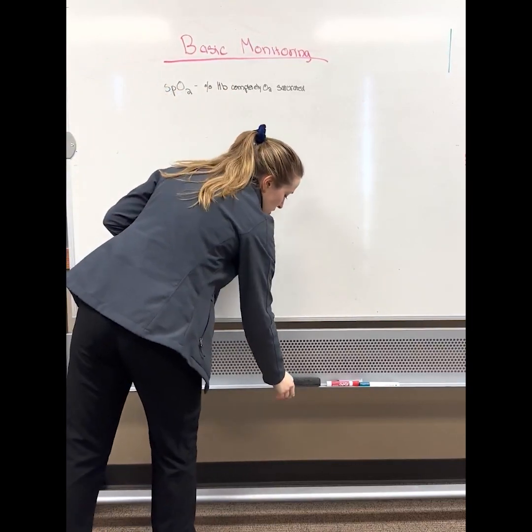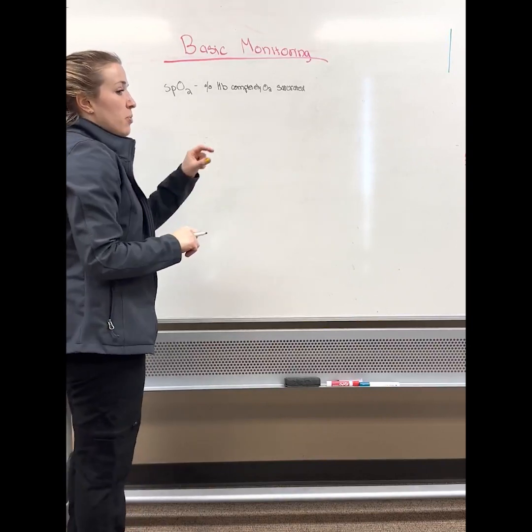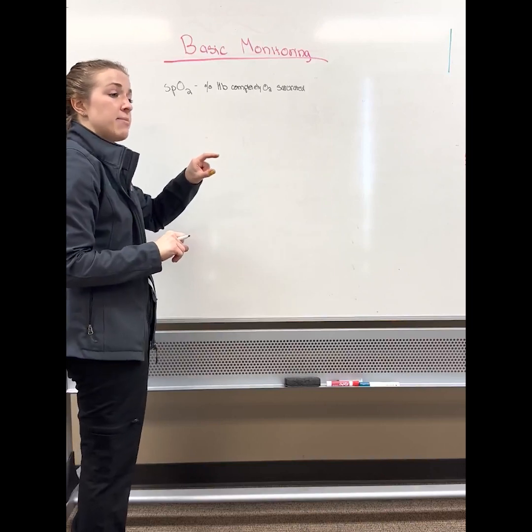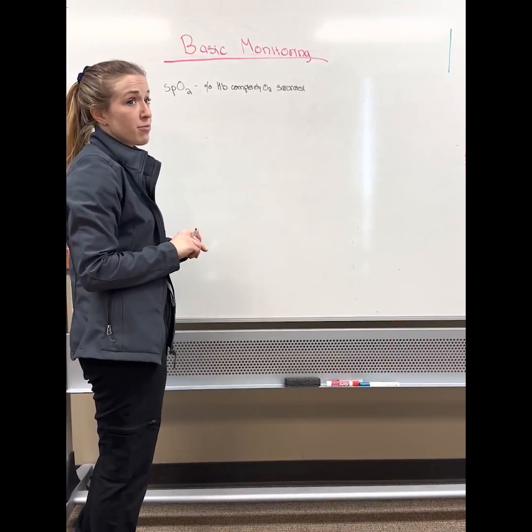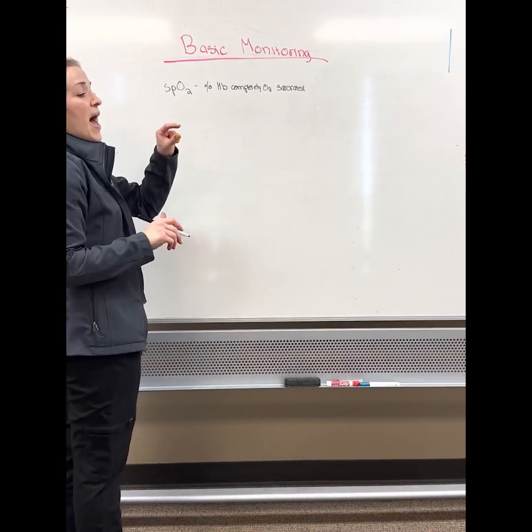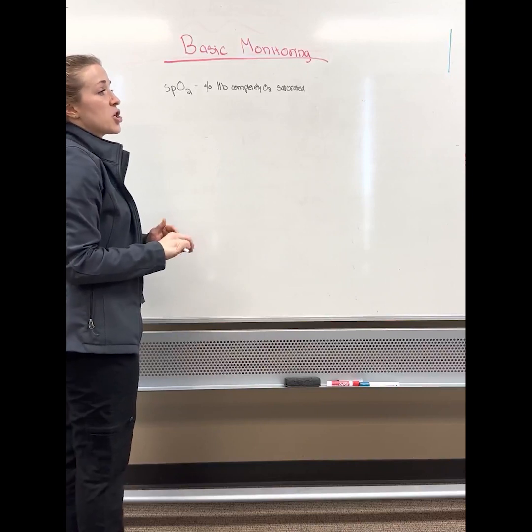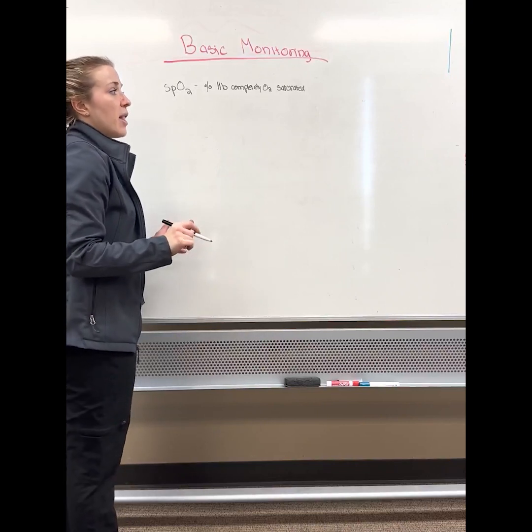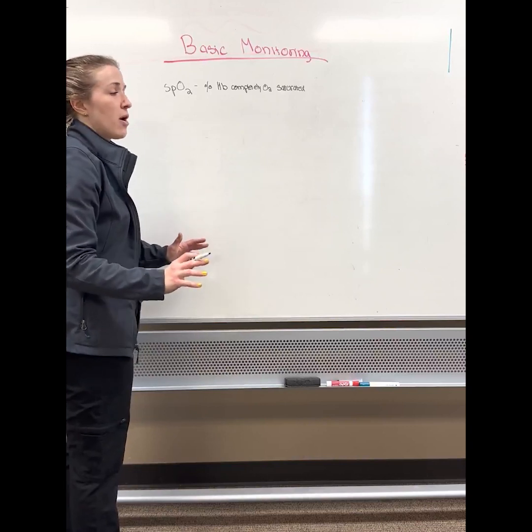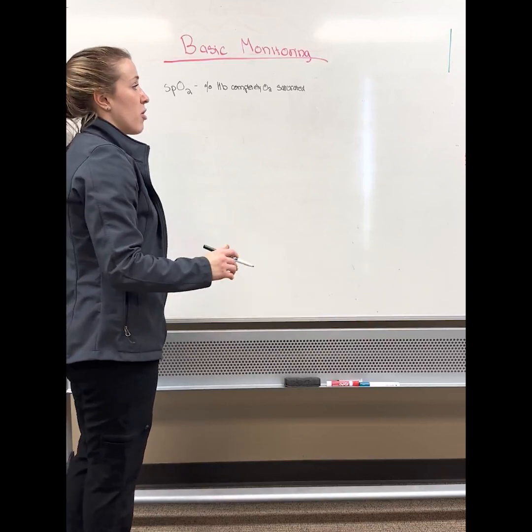The way that the pulse ox works is based on a couple of things. The pulse ox has 2 pieces of equipment: a photodiode and a light emitting diode. The light emitting diode is that red piece of equipment. When you put those 2 little sensors over a piece of tissue, light is going to pass through the tissue, and light is going to be differentially absorbed by different types of hemoglobin, deoxyhemoglobin and oxygenated hemoglobin.